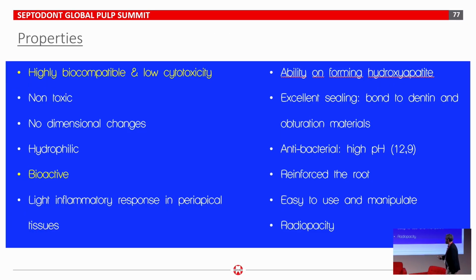These are the properties that we have. It is highly biocompatible and has low cytotoxicity. There is no toxin. It has no dimension changes or expansion. It's hydrophilic. It's because these sealers love moisture. They need moisture to set. They are bioactive because they produce something similar to hydroxyapatite.